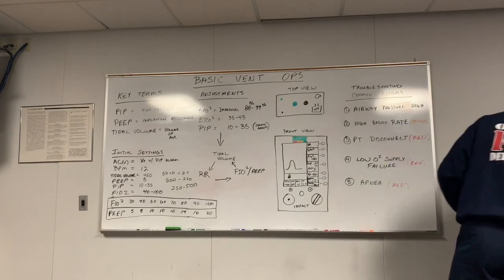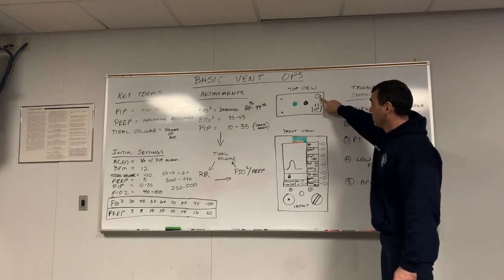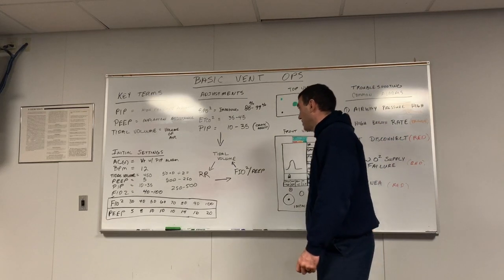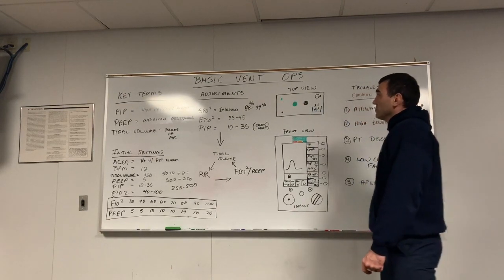The other things that are on top, okay, this is for SpO2. We don't use it. That's why it says NA. And this right here is your AC plug-in for your power. Okay, that's what those are. It's easy to set up when you put it on top because they can't really fit anywhere else except these 2 can be backwards. Just remember, green always goes to green.